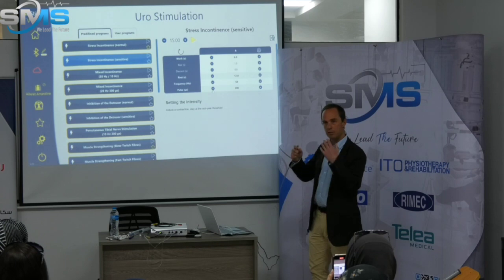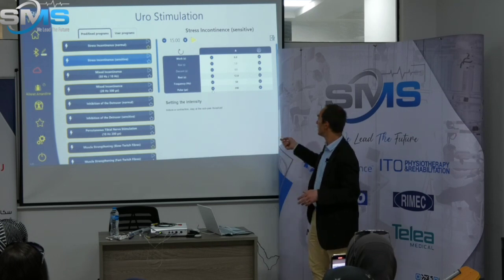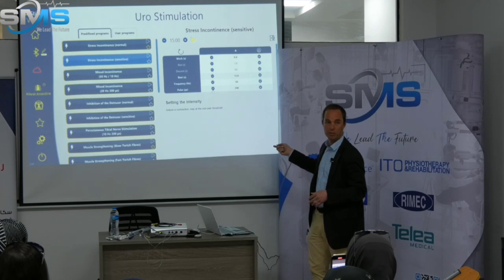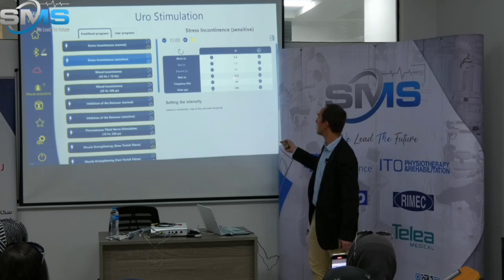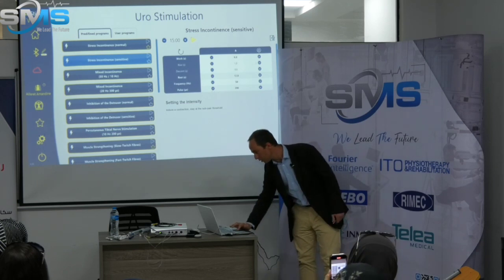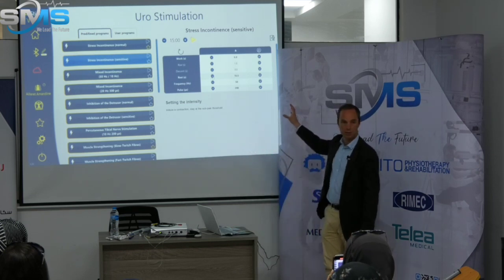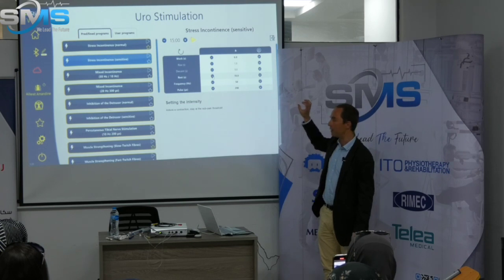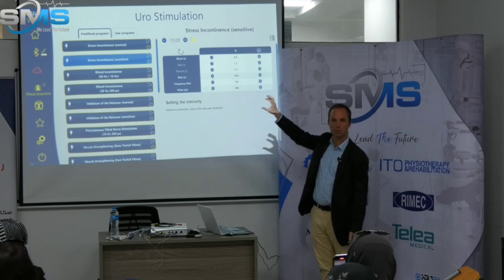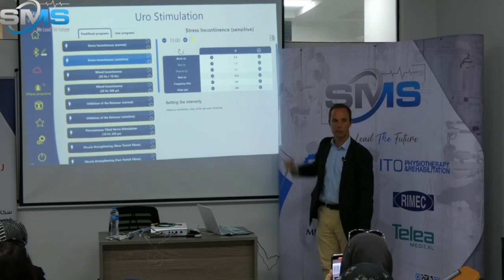And also, that's when you need feedback from your patient. If your patient tells you that she's got a problem when coming back home after the session, you must increase this for next session. So for example, here I could go up to, let's say 18. 18 is enough. And this way, I'm sure that this patient will be treated correctly. So it's very easy to start, but you have full control on what you need. And that's what is very important.